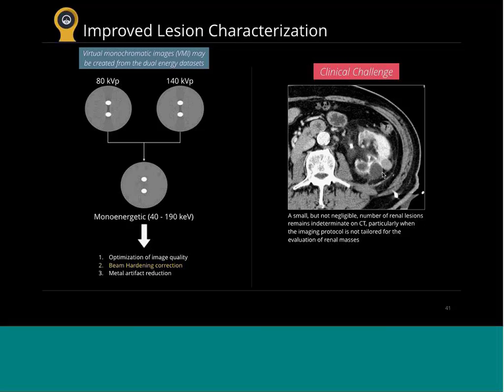But it ends up to have this lesion, this little tiny thing in the kidney. Well, this one, maybe a cyst. This one, maybe a cyst. This one, I'm not so sure. Is that a cyst? It looks pretty dense, but it could be a hemorrhagic cyst. Maybe there's some blood in it. I don't have a true unenhanced acquisition to compare to say how much of this attenuation was already there before we administered contrast, right?